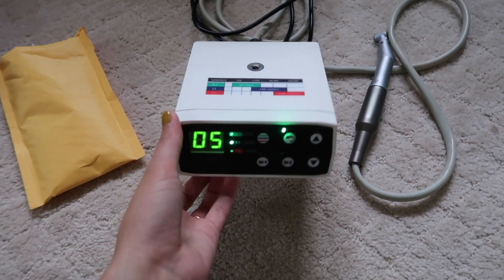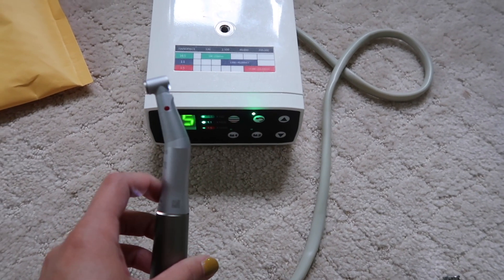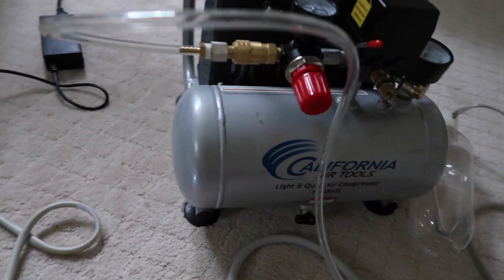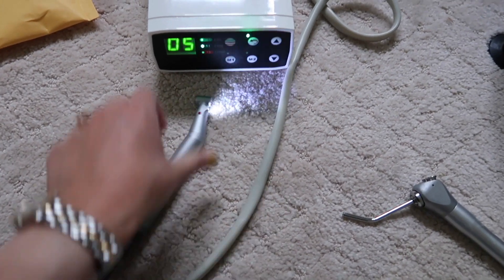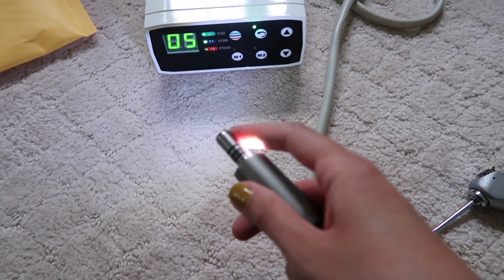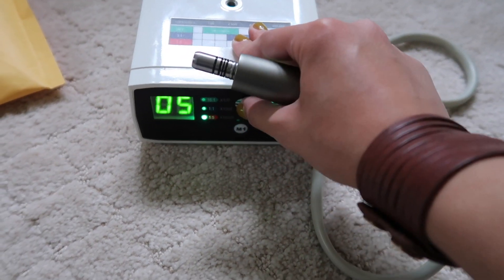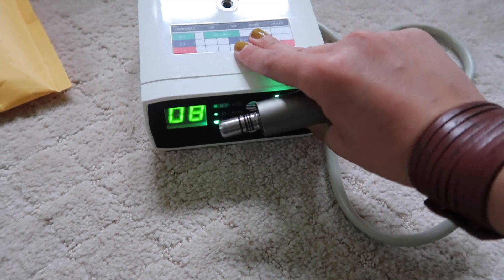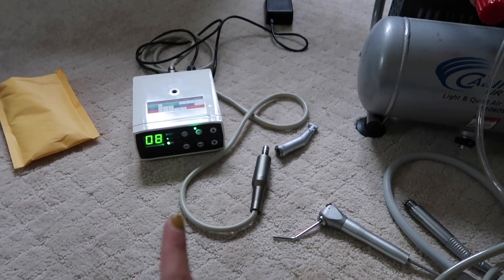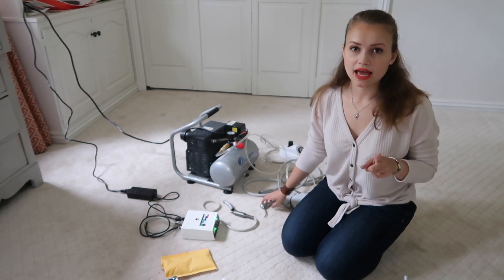This is where the little micromotor unit comes into play — it's much quieter. The only downside is it doesn't have a footpedal, so you press a button to start and stop, which is a bit annoying. But the handpiece that comes with it has a built-in light, and you can adjust the speed — one-to-one for slow speed, one-to-five for high speed. If you have kids sleeping or live in an apartment complex, this is your option. You can't practice quite as intensively as with the big compressor, but it works fine.